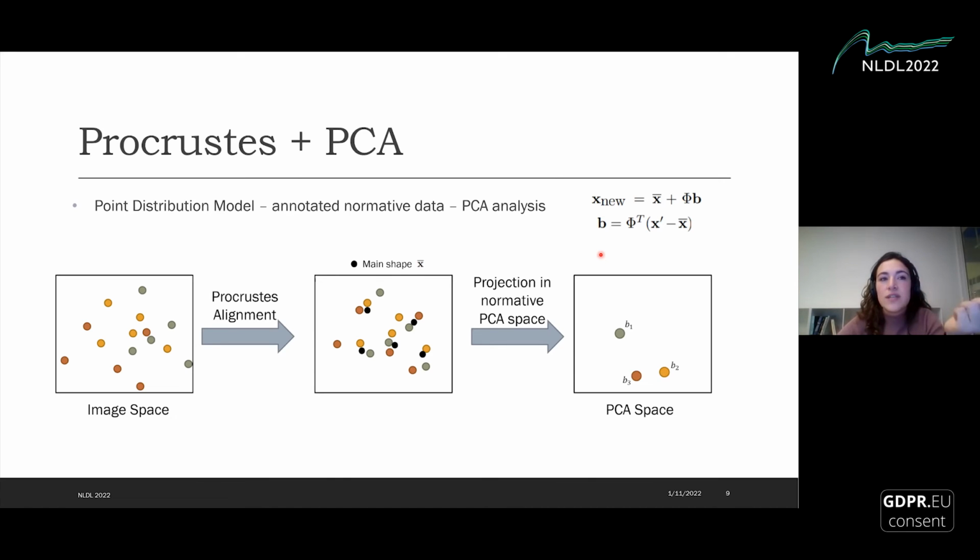We measure the distance between those projections, and we'll use as an evaluation metric the standard deviation of those measurements between the projections.